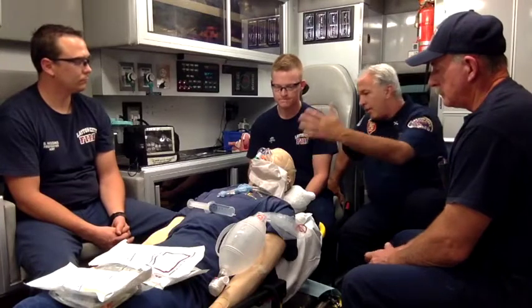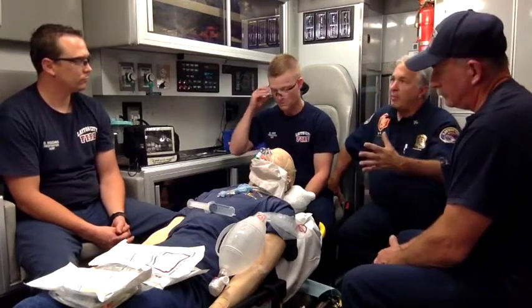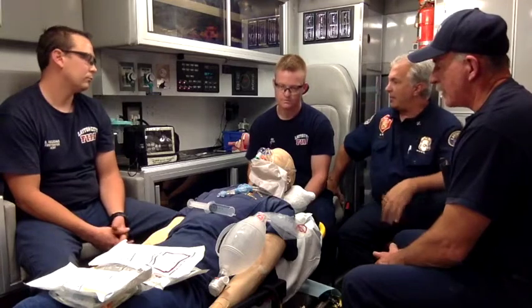Okay, so we get all that done, and we're at that point now. We've made the decision. You know, both the medics are tied up, and the sheriff's office is on its way. And you've made the decision. We're going to put a King in. We've properly sized it. How are we going to do it?